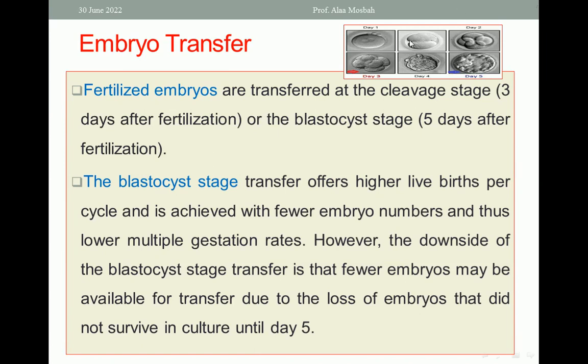as you see in this picture, this is the day 3 cleavage stage, and this is the day 5 blastocyst embryo. Okay.